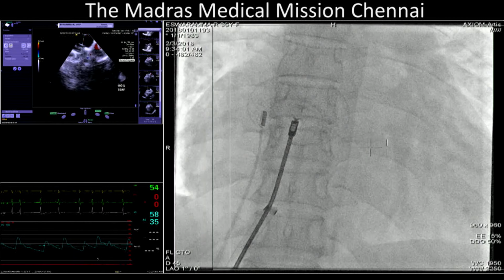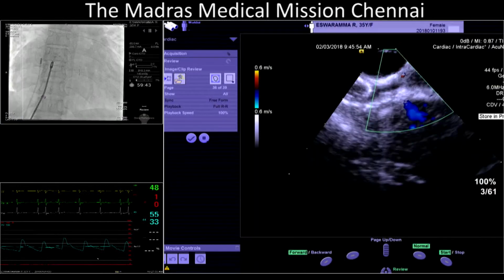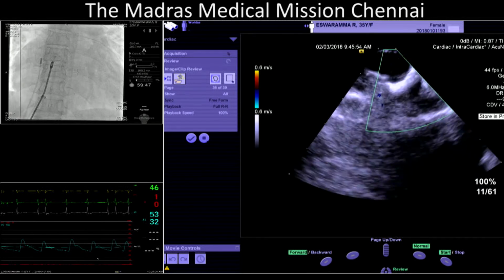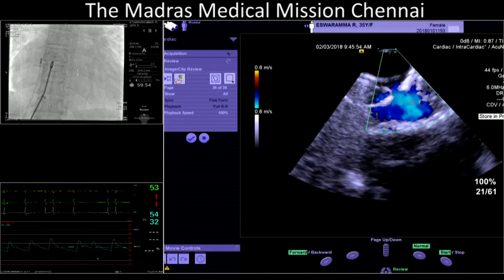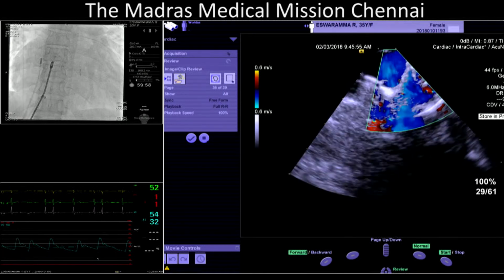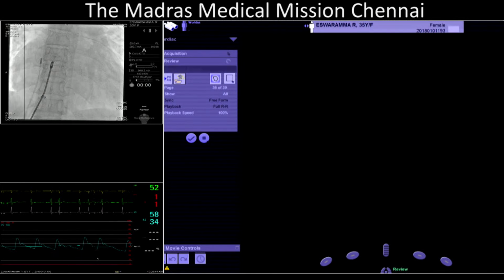Shaq, are you seeing the intracardiac echo? Can you make the echo picture bigger? Yeah, echo bigger, and take the fluoro off. Perfect. So we see shunt for sure. Do you think this is through and through? Yeah, through and through. I will give one contrast. Can you go without color live?